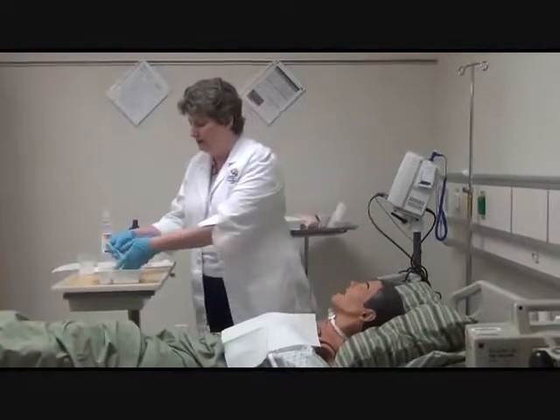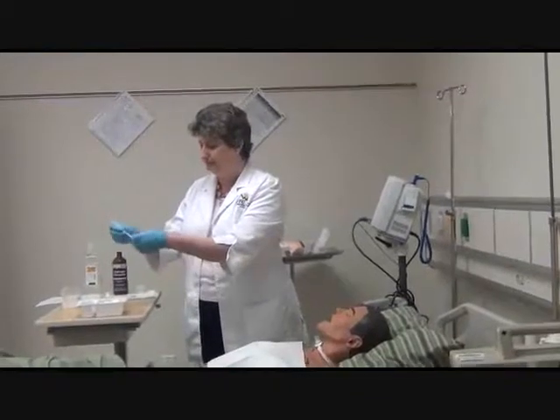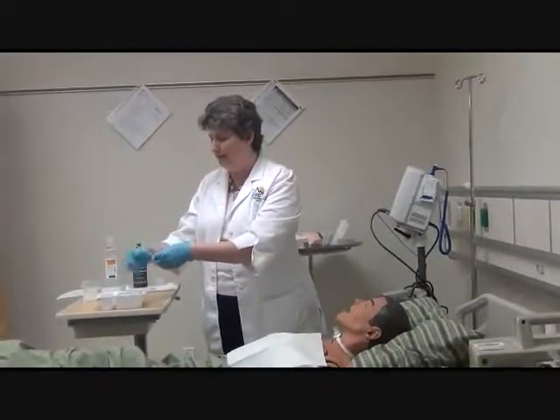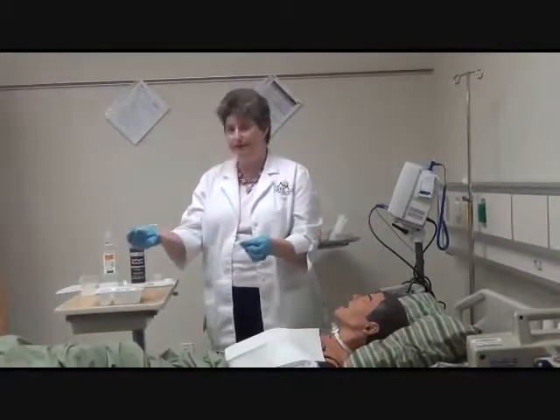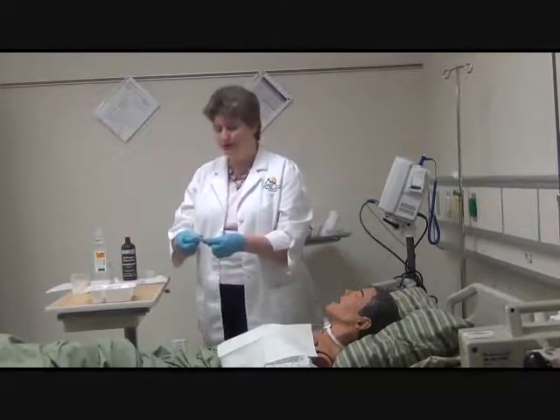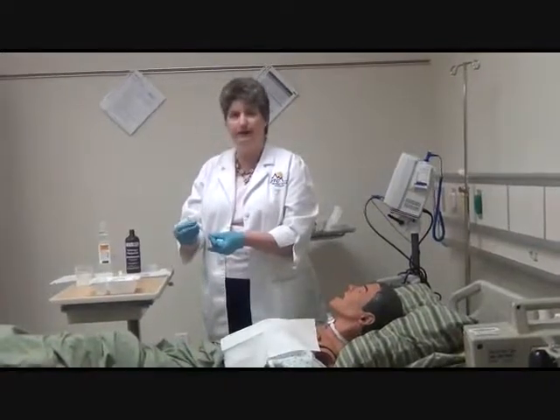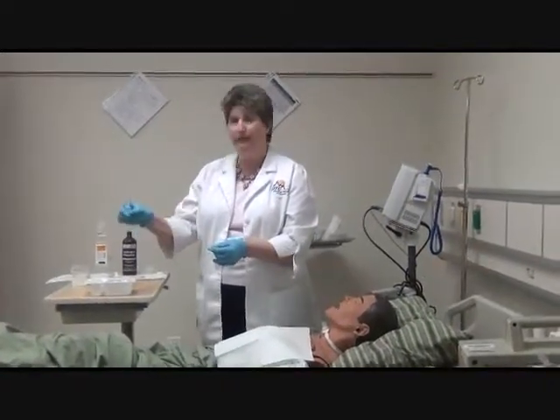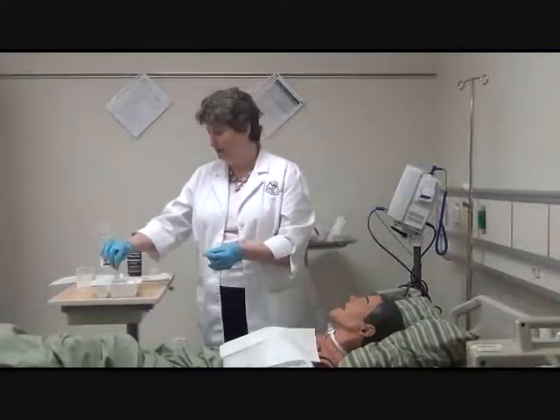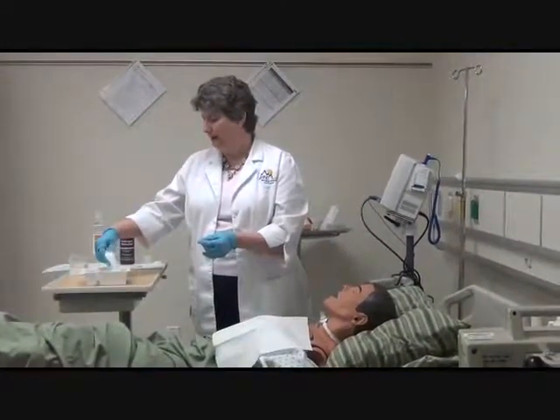Inside your trach kits, you're going to have 3 pipe cleaners. You usually have a couple Q-tips of some kind. Some trach kits also come with a little set of tweezers. These that we're demonstrating with don't have those, but you may see a little set of tweezers. And then you have a little tiny bottle brush. I just leave those in my solutions.